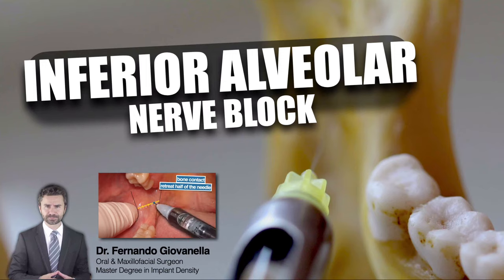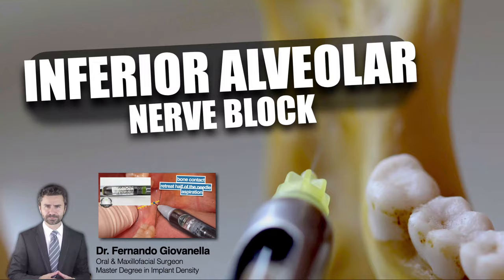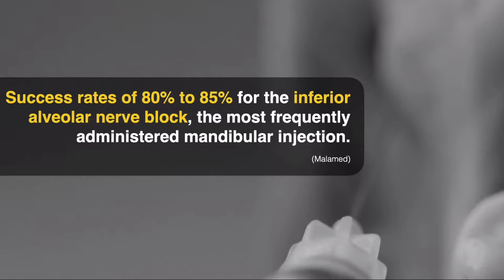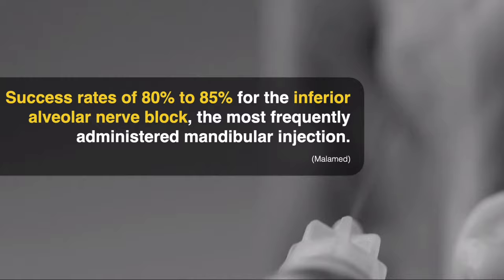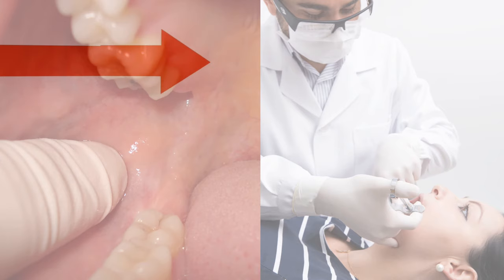The inferior alveolar nerve block is the most widely used in dentistry, and yet many people do it wrong. This video is very important because you will understand the step-by-step of the technique. According to the literature, the success rate of this blockage is 80 to 85 percent, but if you do not execute it correctly, the index drops a lot.